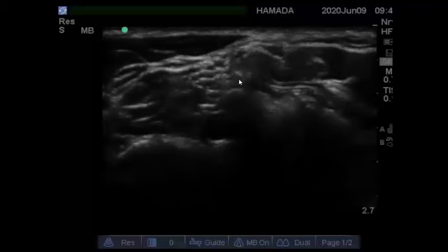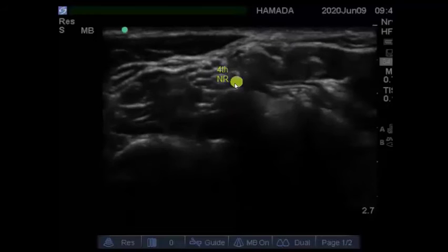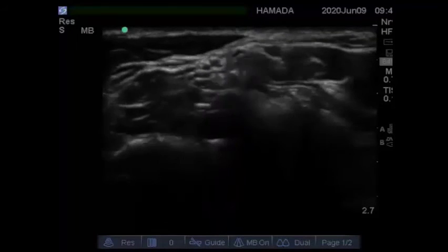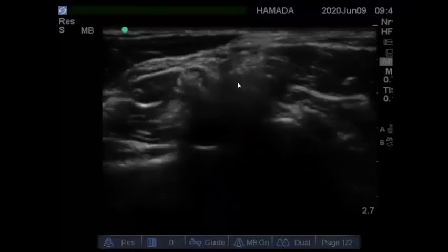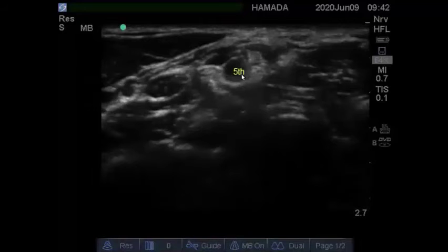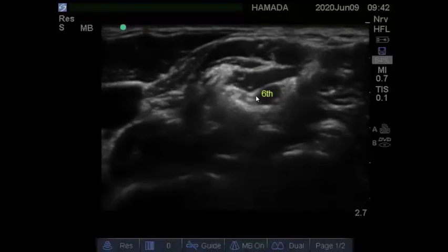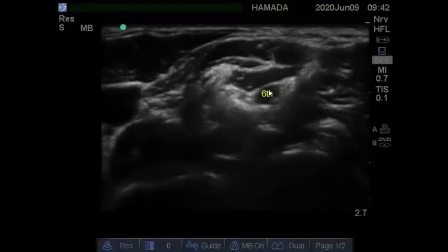This is the sixth nerve root. This is the fourth cervical nerve root, and this is the posterior tubercle and this is the anterior tubercle. Going down more again to see the fifth nerve root here. Going down more — this is the sixth cervical nerve root, this is the posterior tubercle, and this is the longus colli muscle.